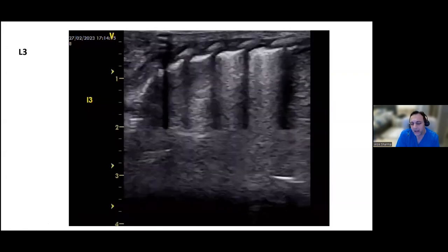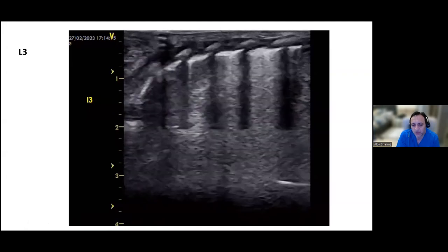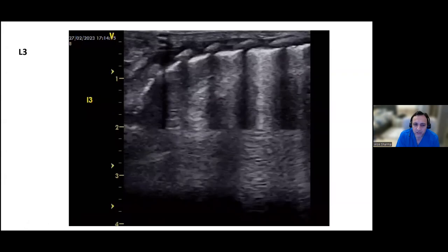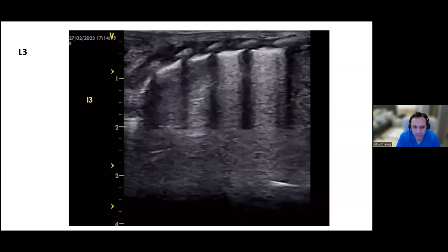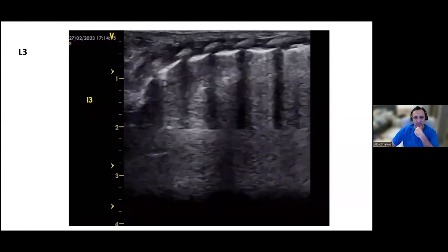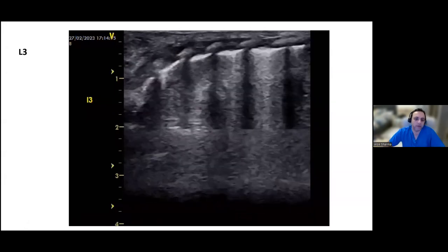Are you using a sharp mode by any chance? You're not using a sharp mode. Okay. And you must have an eye gain function or an auto gain function, because the auto gain will help make the gain uniform throughout the sectors. And again, the deeper part of the lung we're losing out on. So those are things that we can definitely work on.